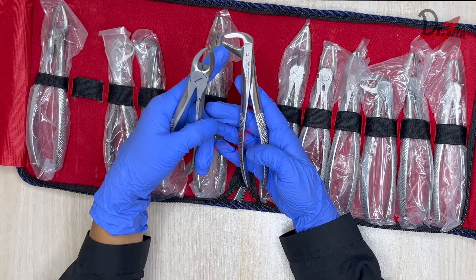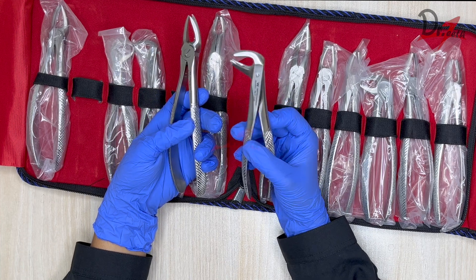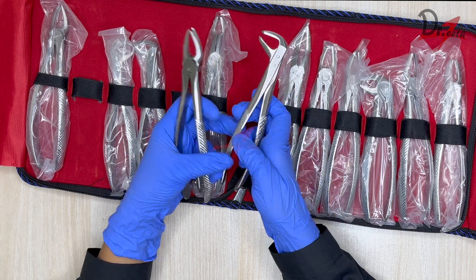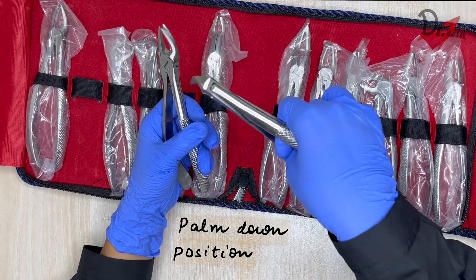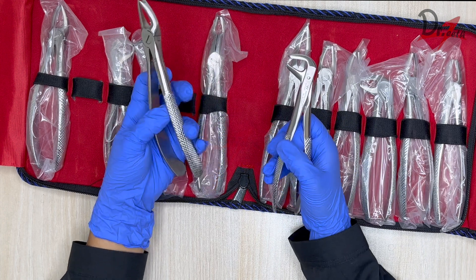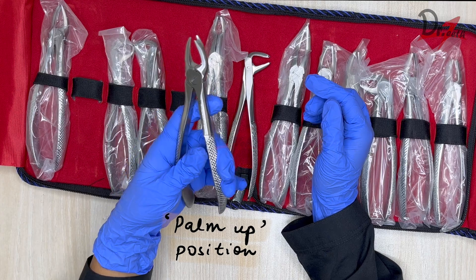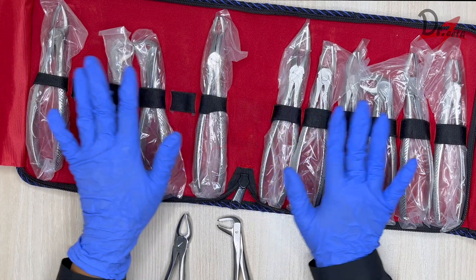If you look here, the beak is parallel to the long axis of the handle. But on this one, the beak is at right angles to the handle. The ones where the beak is at right angles to the handle are the mandibular forceps. All mandibular forceps have this kind of design because when you try to extract a lower tooth, this design is helpful. For the upper arch, the other design is more ergonomic and suitable. This is the basic difference between the upper and lower forceps.